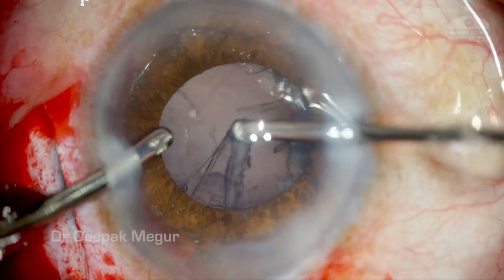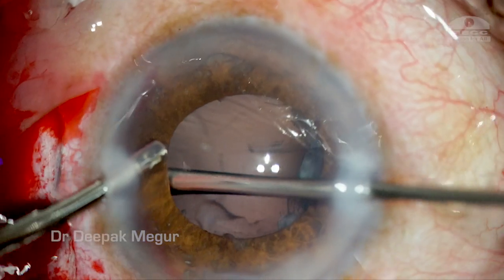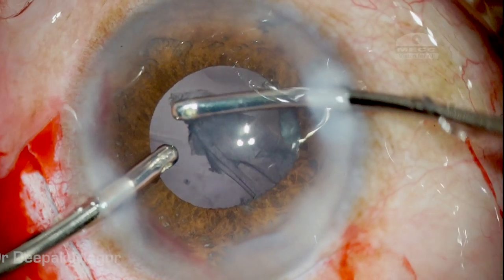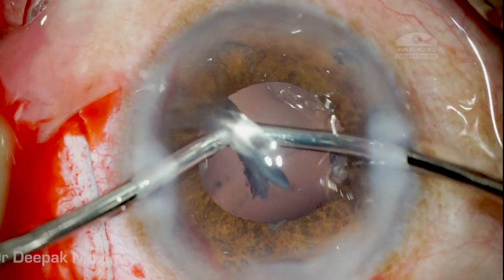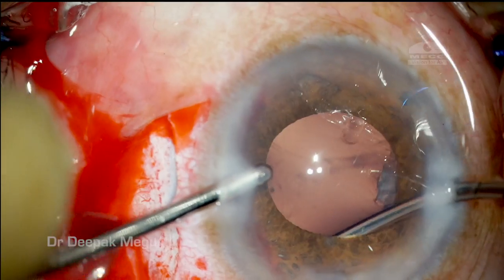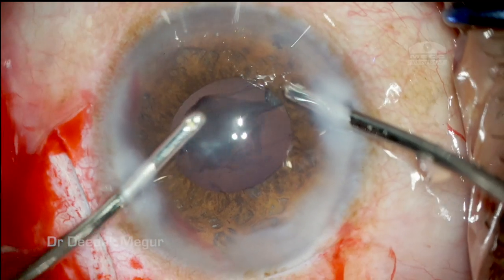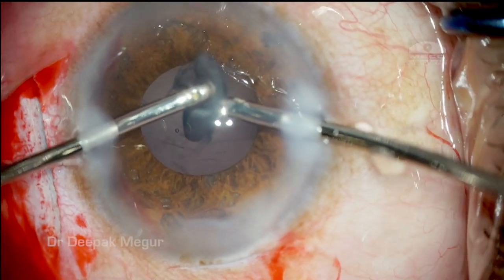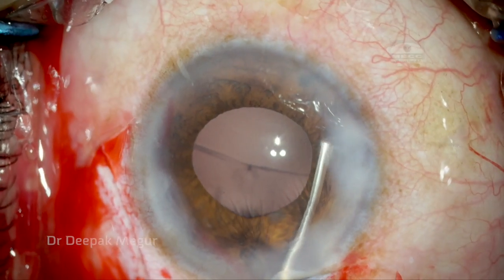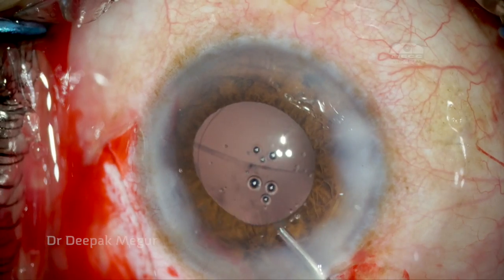After performing adequate anterior vitrectomy, I remove the cortex using the cutter in I/A mode, then switch to the bimanual cannula for cortex removal. An important point: cortex aspiration must be done only after adequate vitrectomy, when the vitreous is totally clear from the anterior chamber.